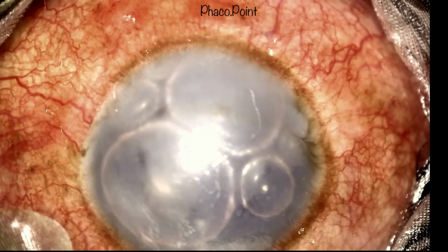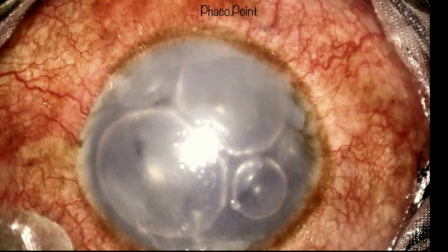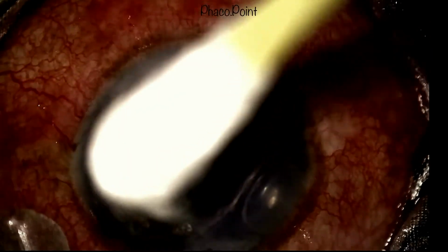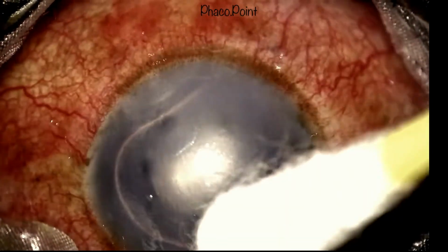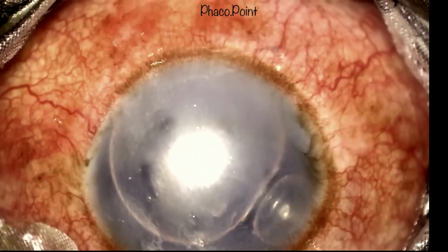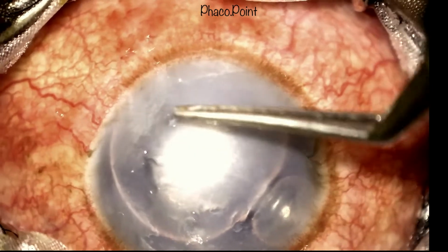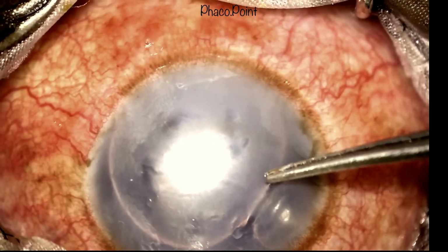I keep intermittently injecting some more air into the anterior chamber, and note how bubbles of liquid are seen in the venting incisions, which are then subsequently wiped with the cotton bud. This procedure of intermittently injecting air into the anterior chamber is repeated until a point when no fluid appears at the venting incisions. In order to aid the extrusion of the fluid from the venting incisions, sometimes, as you can see, I use the McPherson's to press and splay open the openings of the venting incisions.